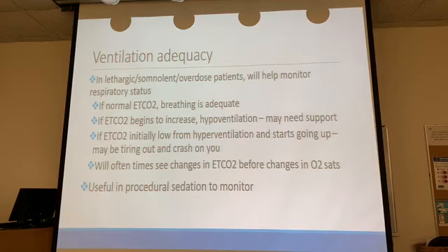So if you're going from a normal end-tidal CO2 and now all of a sudden it's climbing to 50, it's climbing to 60, that means this breathing is slowing down way too much. You may not see that O2 sat drop for 2-3 minutes, but you better go ahead and get your bag out and you better start supporting them, because they're about to start desaturating on you, okay? End-tidal CO2 starts changing before any of the other vital signs start changing, before blood pressure, before O2 sat, before the patient loses their pulse. So very, very unique tool.